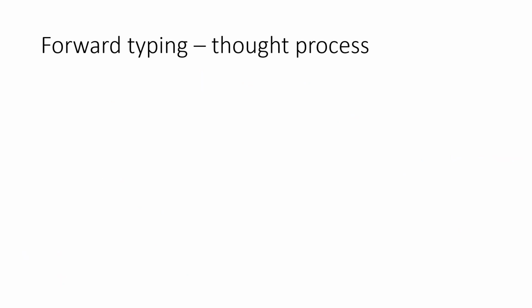So one of the more common types of discrepancies with forward typing is with the group A. And so I'm going to focus on that for the next 2 slides because it's the most common thing that we run into with A subgroups. So when thinking about A subgroups, they give us usually forward typing that's off and sometimes reverse type that's off if they form an anti-A1. But let's focus just on the forward typing.